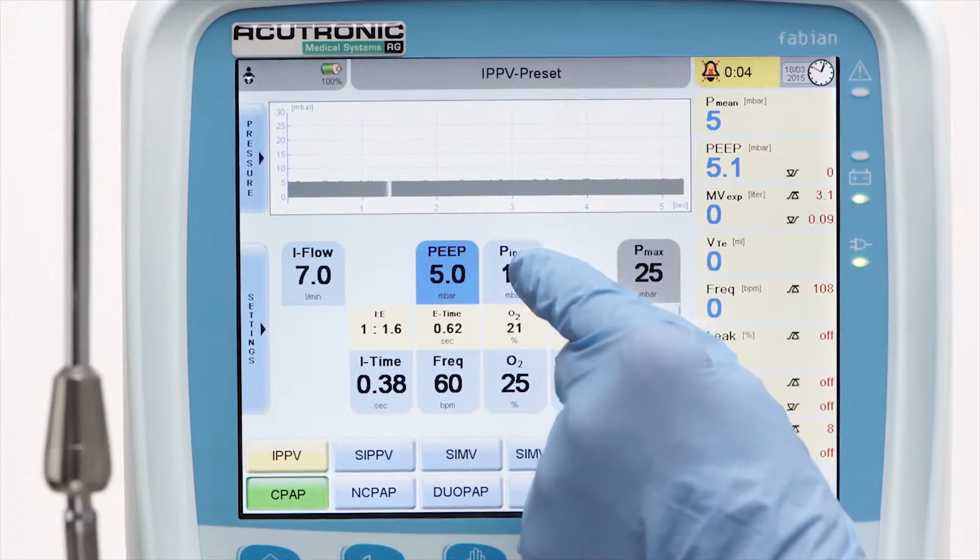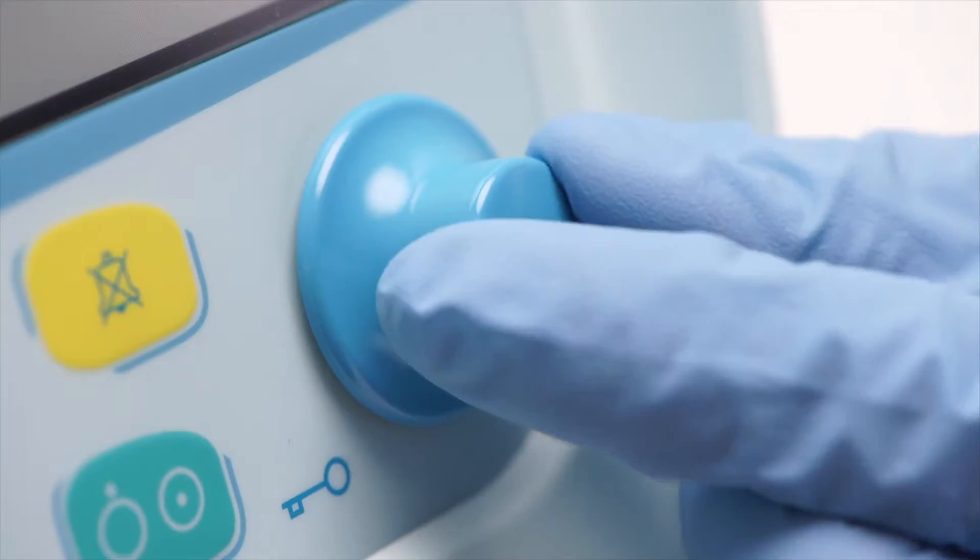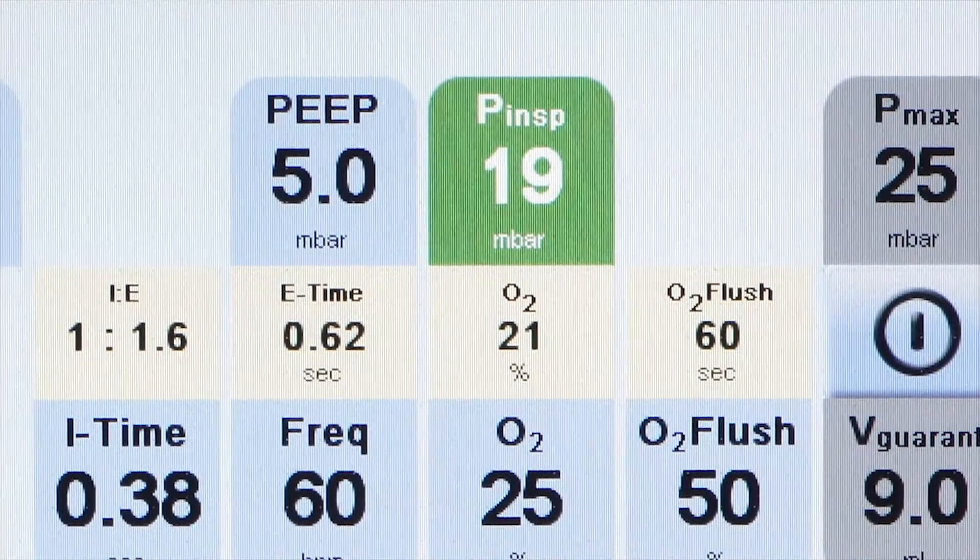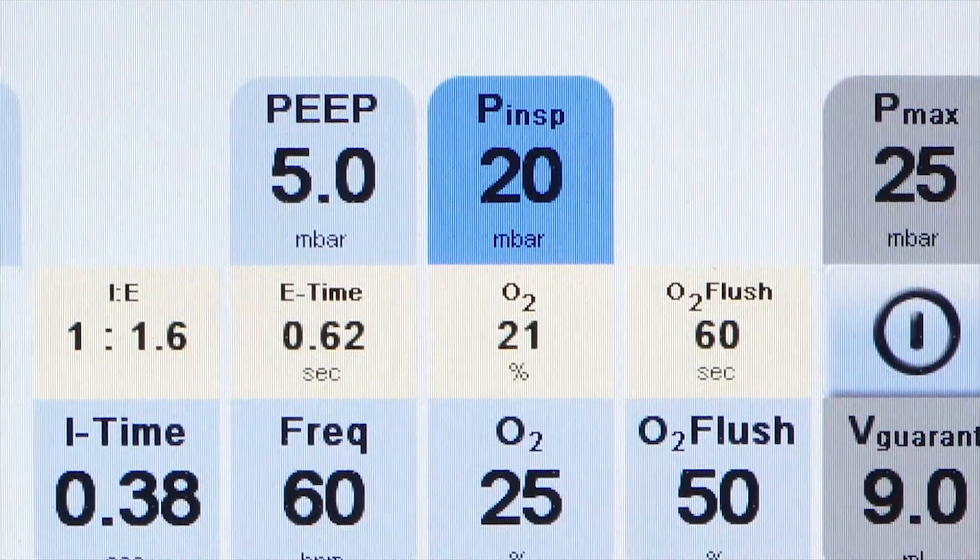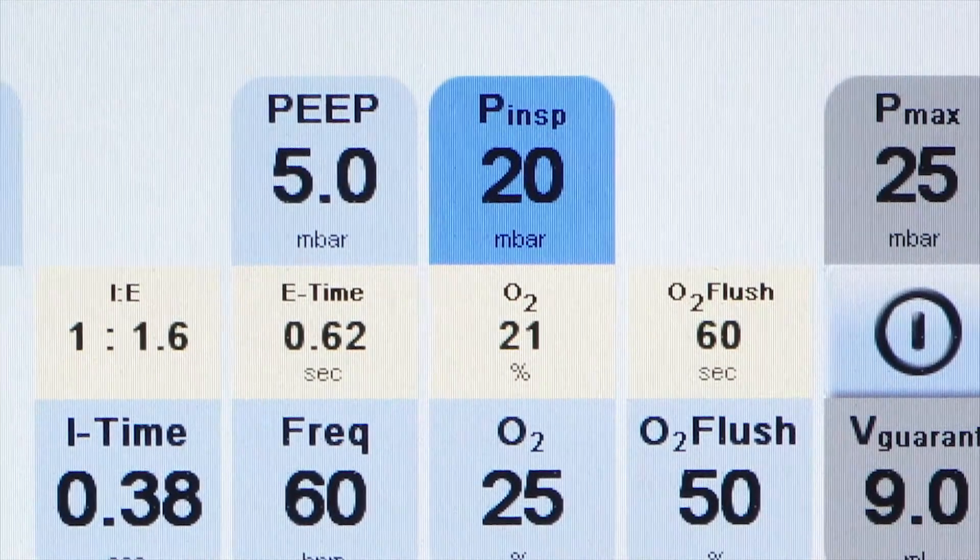P-INSP. 16 to 18 centimeters of water, depending on clinical protocol. This pressure controls the tidal volume. It should be set to 4 to 6 milliliters per kilogram of body weight.